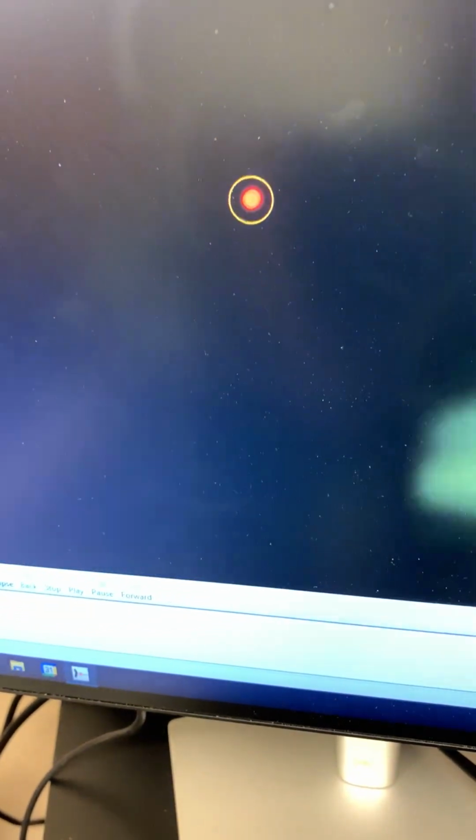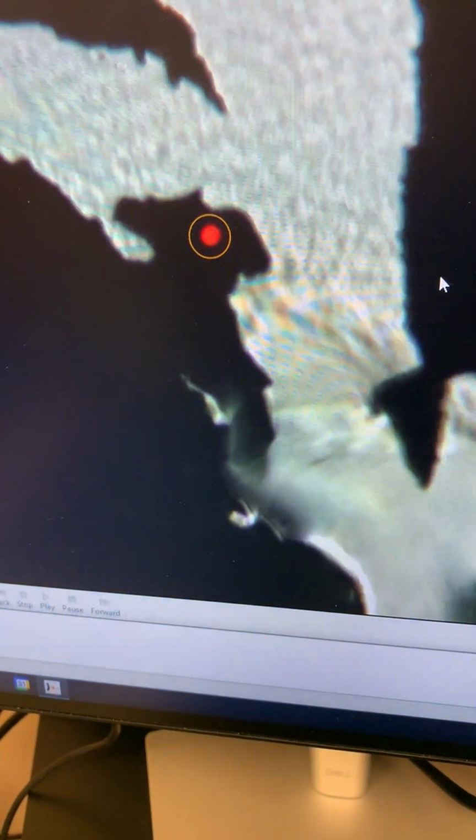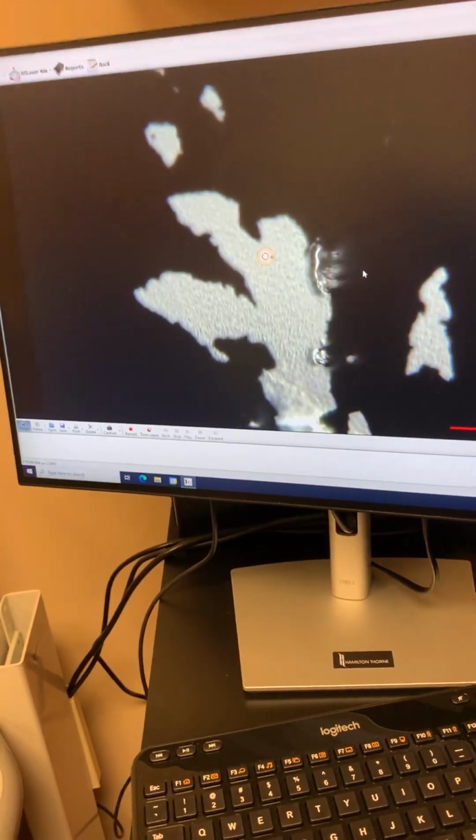All right, let's go up to our objective. Let's see if this one works. There you go. Oh, I see it. It punctured a hole in it. Yep. So I'm just shooting it with my foot, and you can hear it kind of making those noises. I'm in this really dark area, but trying to find a not as dark area. Whoa, there's lots of dark areas.